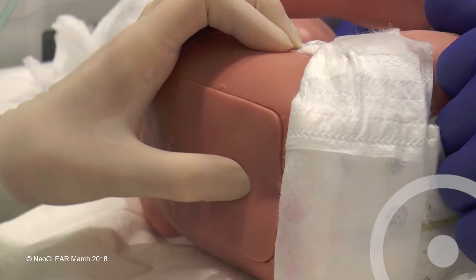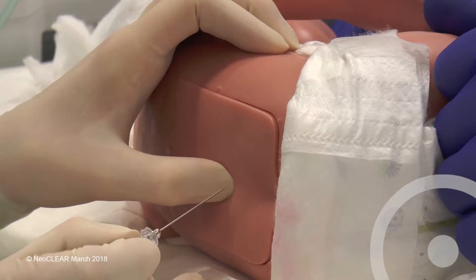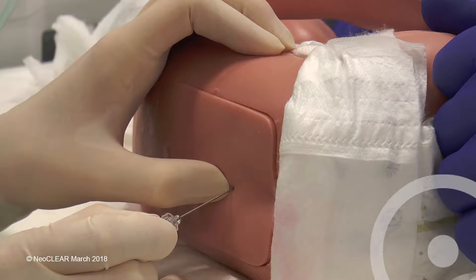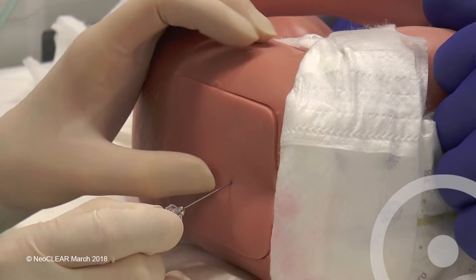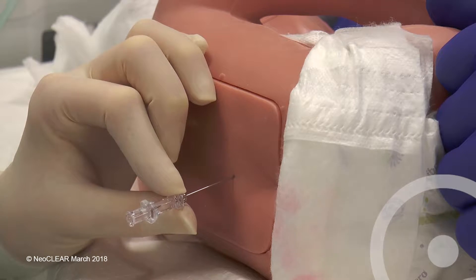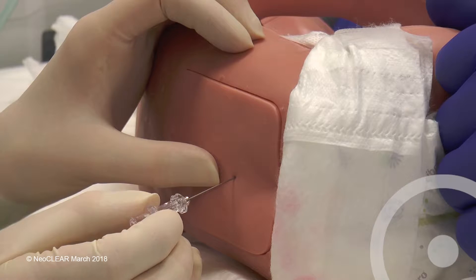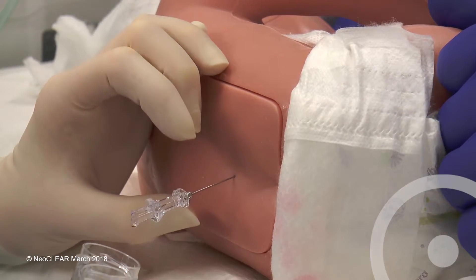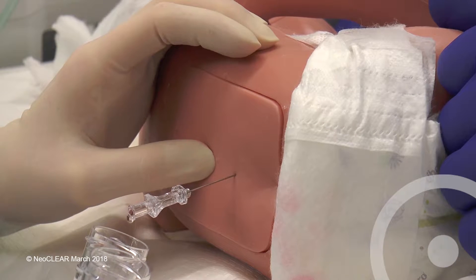With the infant held firmly in the lying position, insert the needle with the bevel facing to the infant's side upwards. When the needle is through the skin and the subcutaneous tissue, hold the needle in place and remove the stylet. For early stylet removal, slowly advance until CSF is seen in the hub of the needle.